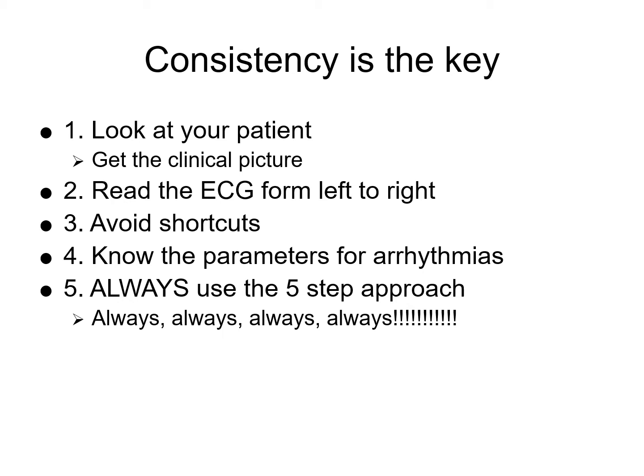Again, you're reading from left to right. Avoid any shortcuts. Know the parameters for arrhythmias, and use the 5-step approach: your heart rate, heart rhythm, your P waves if they're present, your P to R interval, and your QRS complex.